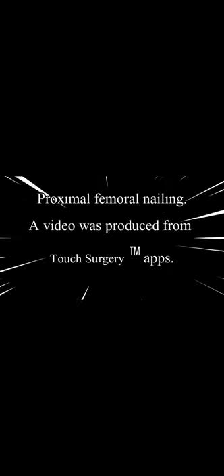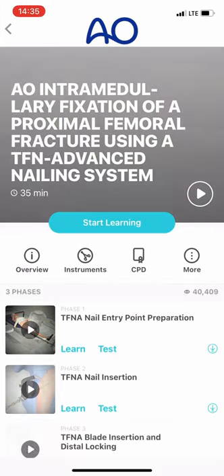Proximal femoral nailing. A video was produced from Touch Surgery Trademark Apps.